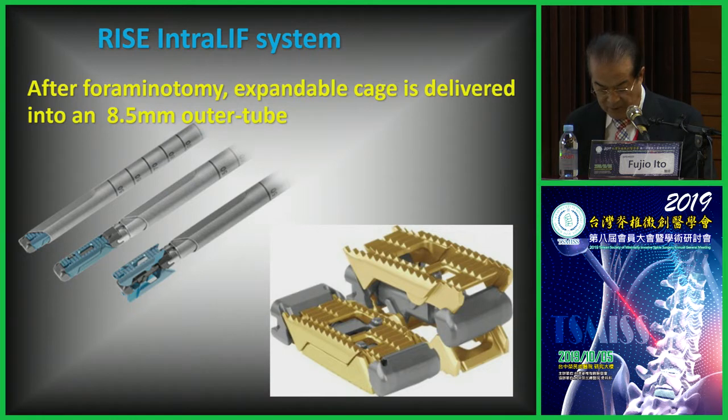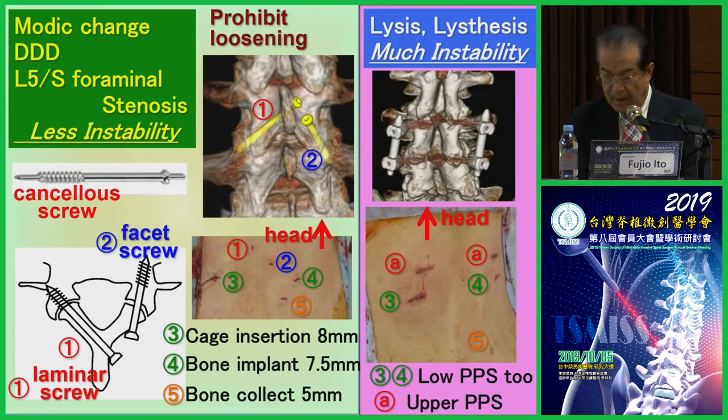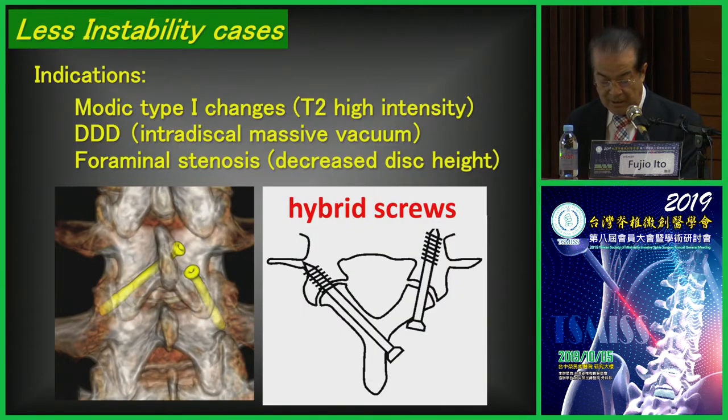After partial foraminotomy, the expandable cage is delivered through an 8.5 millimeter outer tube. The facet screws are fixed for less instability, such as Modic change, DDD, and L5S1 foraminal stenosis. PPS are used for much instability, such as spondylolisthesis. Even in the case of PPS, the endoscopic portal and lower PPS portal can be shared, so it is limited to 5 small incisions. Less instability cases are fused using the hybrid facet screws method.